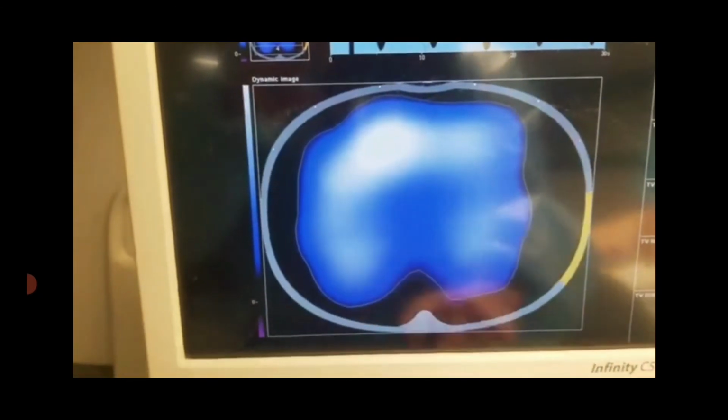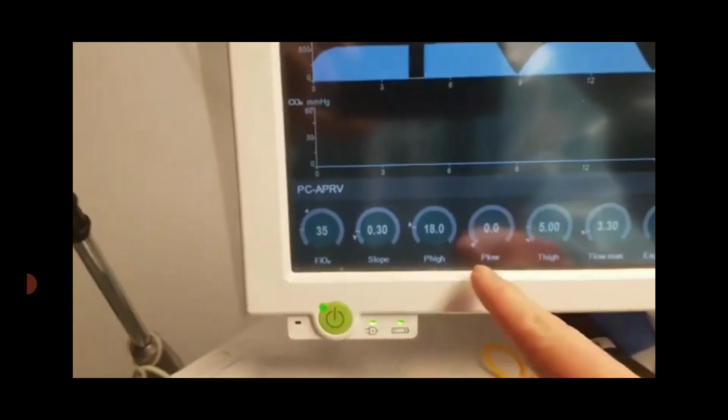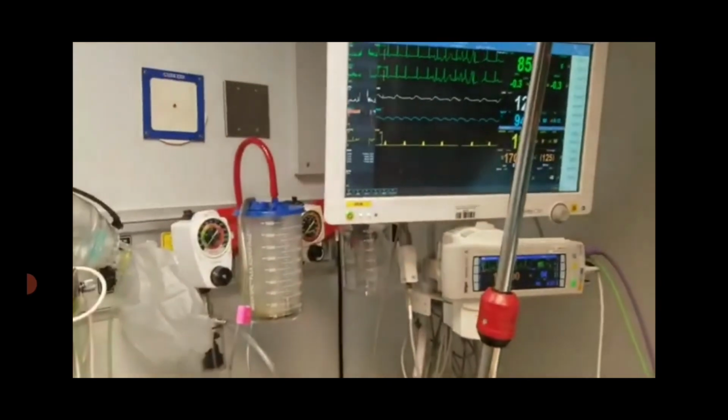Boom! I love my job. He's down to 35%. We got a P high of 18, and he's sitting 94.